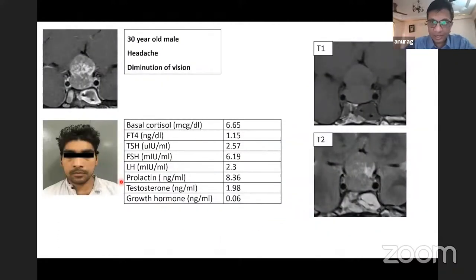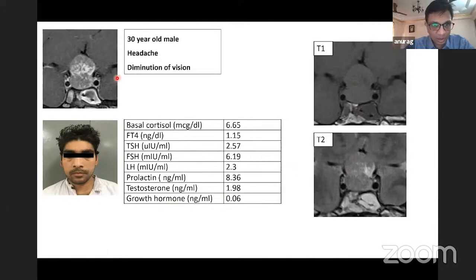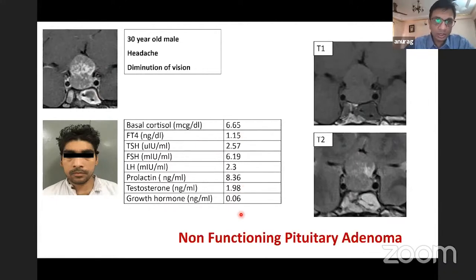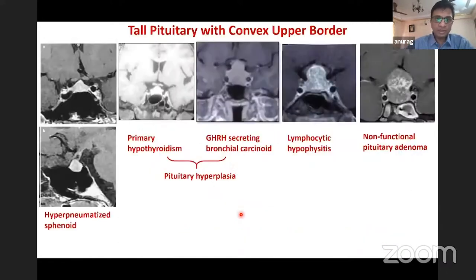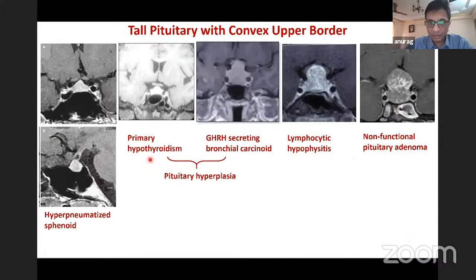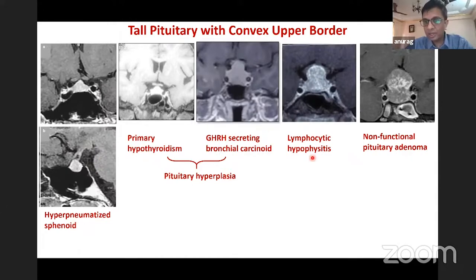This young man with a figure-of-eight appearance showed T1 and T2 isointense signal with some heterogeneity in T2 and contrast enhancement on T1 contrast. There was involvement of the gonadotropin axis. This is a case of non-functioning pituitary adenoma with a classical figure-of-eight appearance.